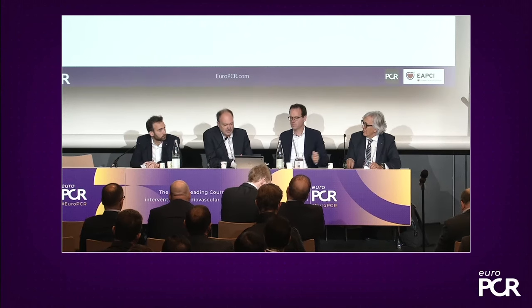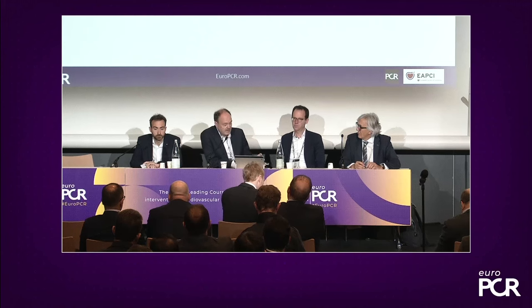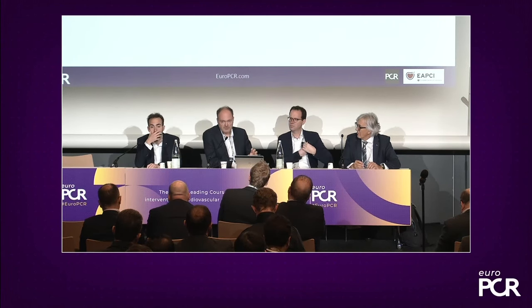Yeah, that's a very good question. I think practically, IABP is a little bit smaller than the impellers we have in Europe at the moment. That will change in the future. I think the IABP might not be strong enough in view of afterload reduction to have that beneficial effect. There is data showing that IABP might also help. I showed that review paper and the ELSO paper. I think that's quite a strong database. This was not associated with a reduction in mortality.